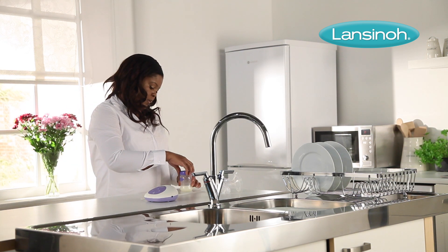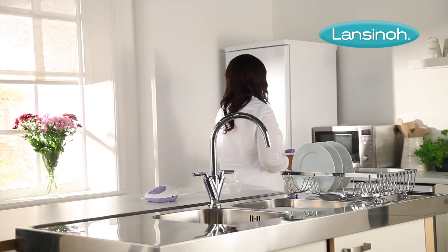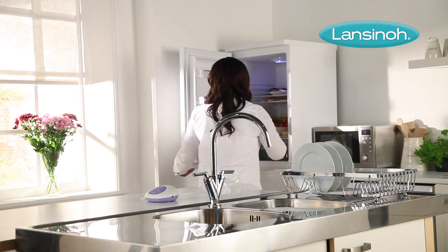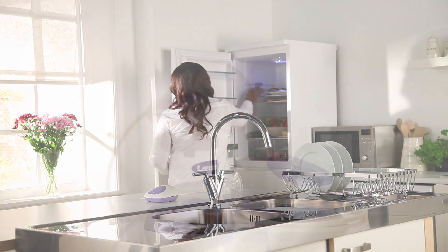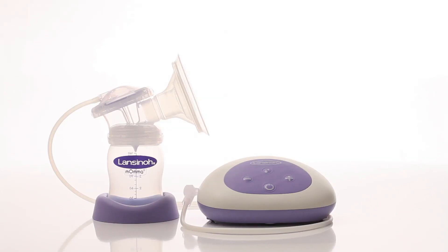Including a complete pump, store, and feed solution, the pump offers the flexibility busy mums need. The single electric breast pump from Lansinoh — helping mums breastfeed longer.